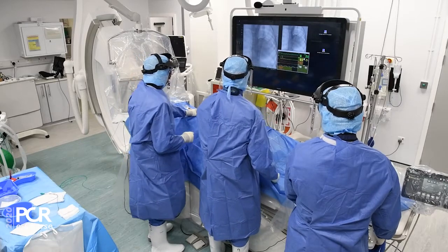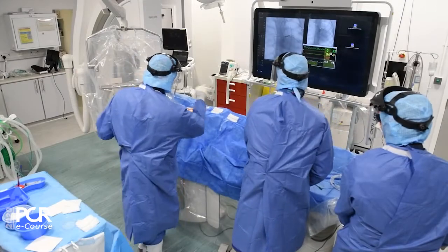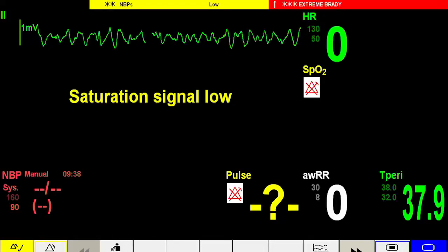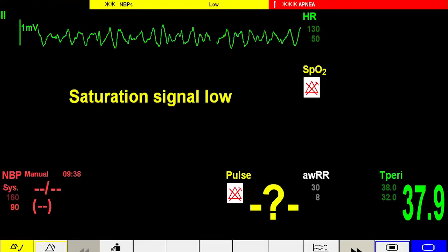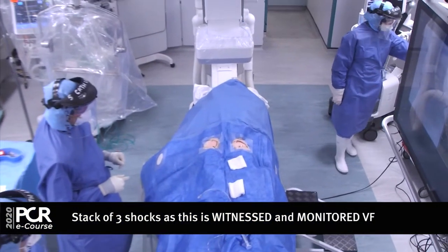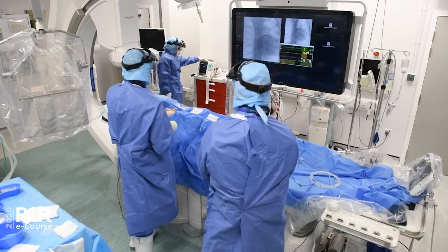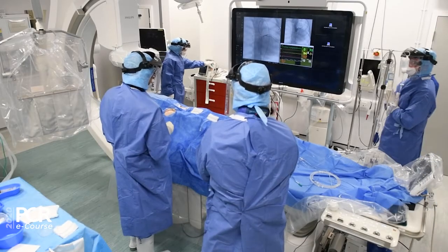Oh, okay. So that looks like a VF. Okay, back him up. So it's VF. Okay, back him up. Can you shock this patient? Get the camera up. Get the camera up. Okay, shock. Oxygen away. Shocking. Shock delivered. Okay, still carry on. Another shock. Okay, charging.